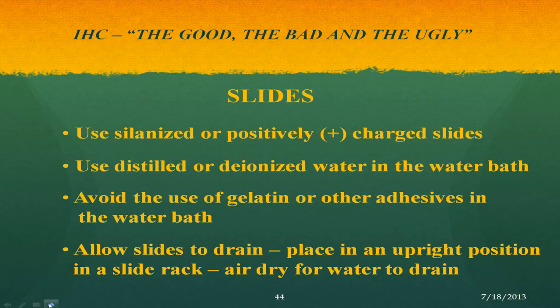Always, always, always. We've had people in our lab that, when they're cutting the slides, forgot to use their positive charge slides. It slows getting that patient outcome. It slows getting them to the pathologist, so always use positive charge slides. And always use distilled or deionized water in the water bath. And avoid the use of gelatin or other adhesives in the water bath, because that's going to cause background staining in your IHC.